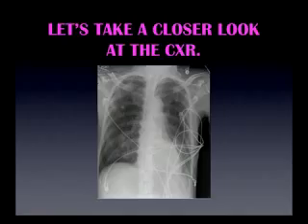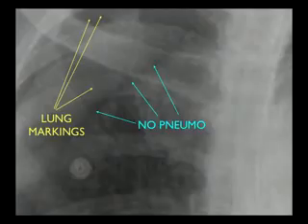Let's go back and look at the original X-ray. There clearly seems to be a line in the right, but this is with magnification.